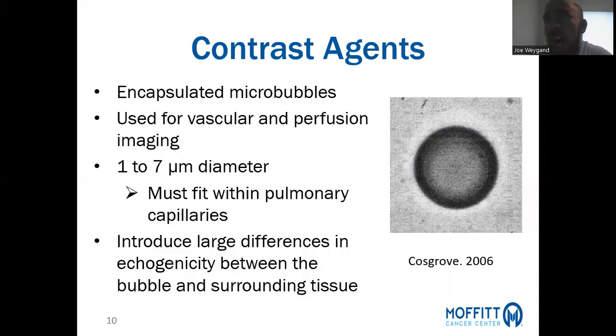So as in other imaging modalities, ultrasound makes use of exogenous contrast agents. Whenever you want to design a contrast agent in a given modality, you would want to introduce a substance into the patient's body that modulates the parameter that is exploited for contrast in the imaging modality. So for example, in computed tomography or CT, you're exploiting density of tissue.